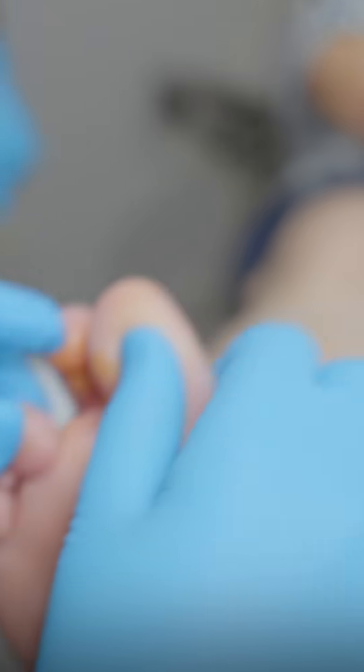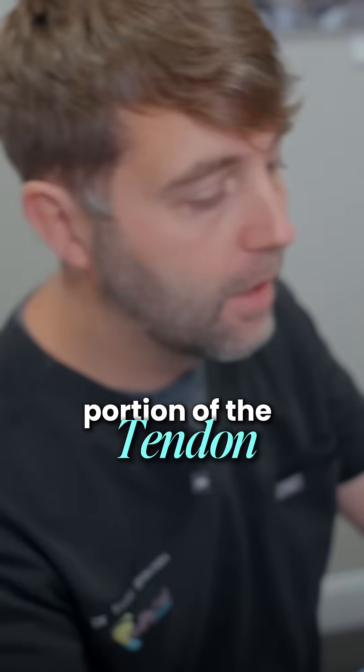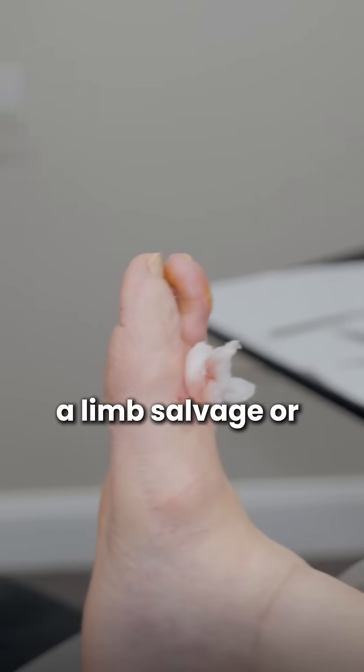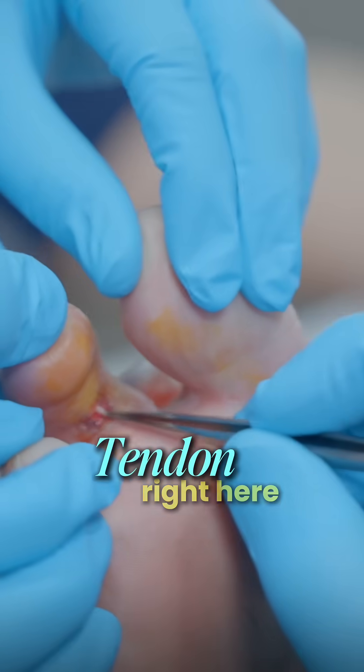The plan for today — and we've gone through discussion with the patient — is that we're going to excise that portion of the tendon. The ultimate goal at this point is limb salvage, or toe salvage. You can see this is tendon right here.